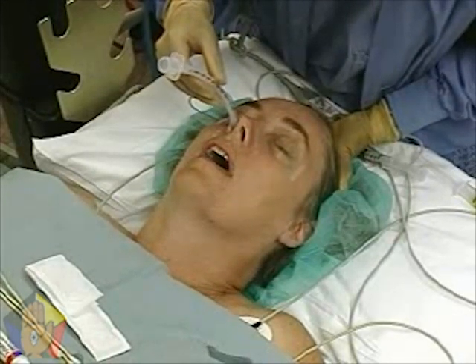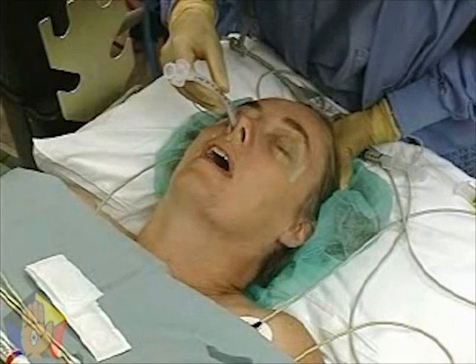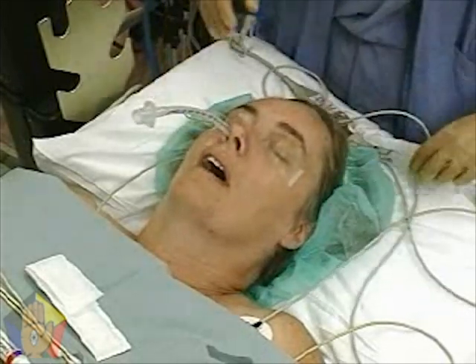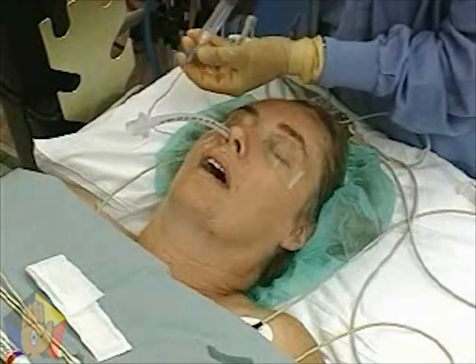Ask the patient to breathe deeply and gently advance the tube through the cords while they are open during inspiration. The patient should immediately lose phonation. Inflate the cuff, verify position, and secure as for an oral endotracheal tube.